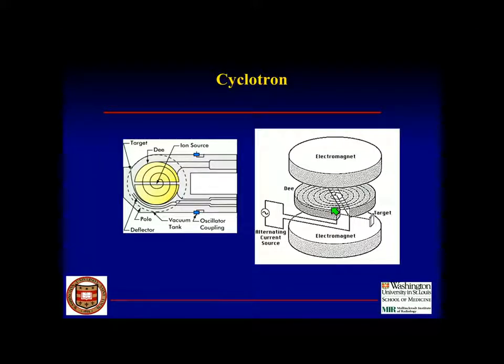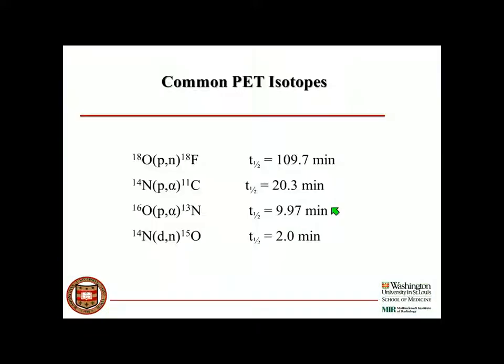So essentially, a cyclotron is a device that accelerates particles in a circular path. They're actually maintained in between the poles of the electromagnet. So what's going to happen is the particle will be injected essentially into the center of that, the Ds, and then it will be traveling to the outer area of the cyclotron where it's ejected and it hits its target material.